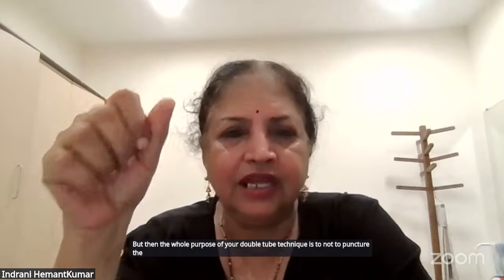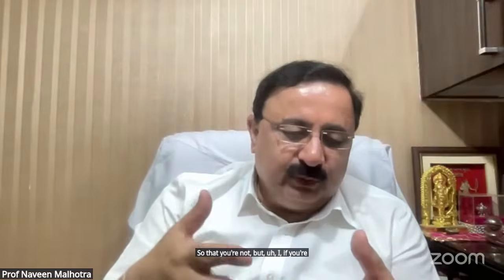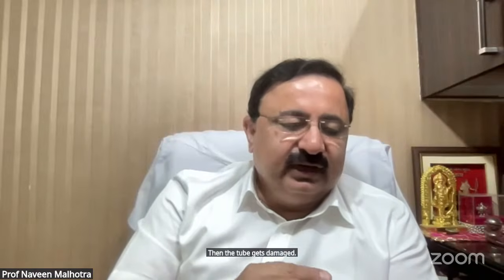But then the whole purpose of your double tube technique is to not puncture the cuff. That was the whole purpose. But sir, we experienced that the tube has to negotiate an angle, so hold it from above the cuff. But if you put Magill's forceps at the cuff or below the cuff, then the tube gets damaged. The cuff will get damaged.